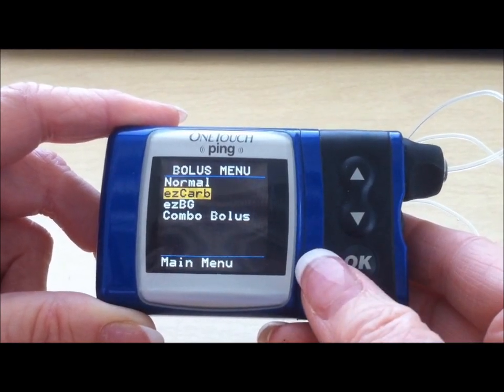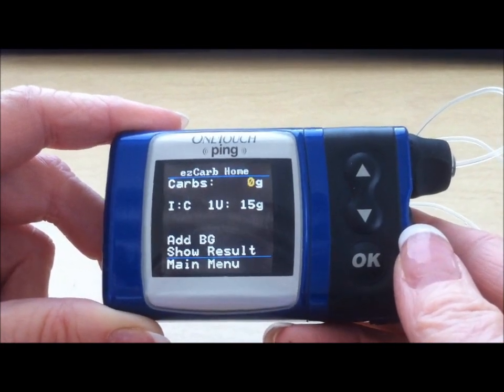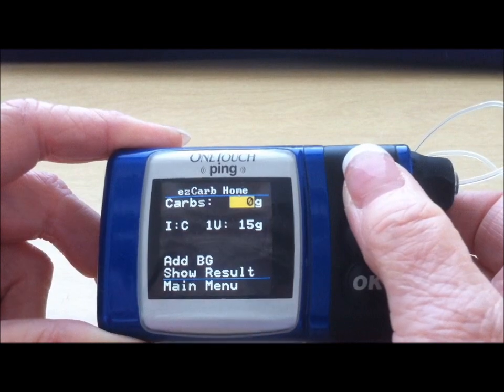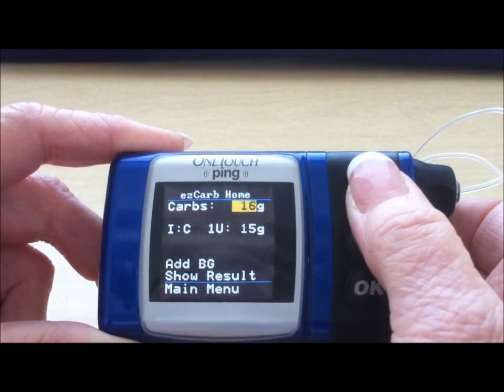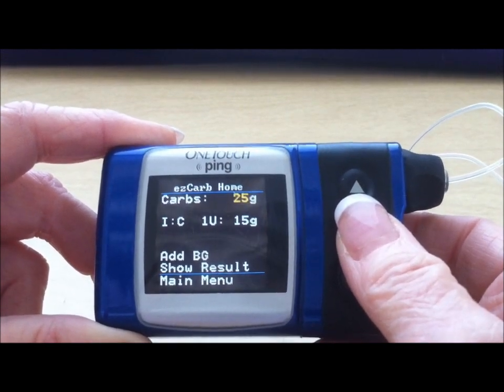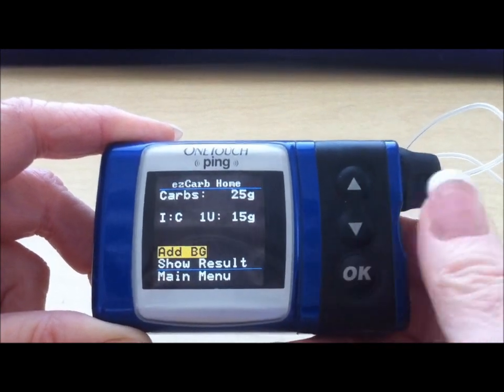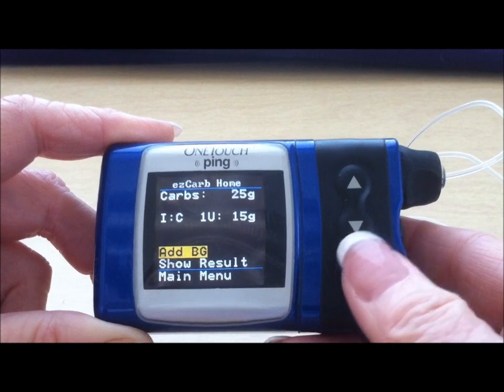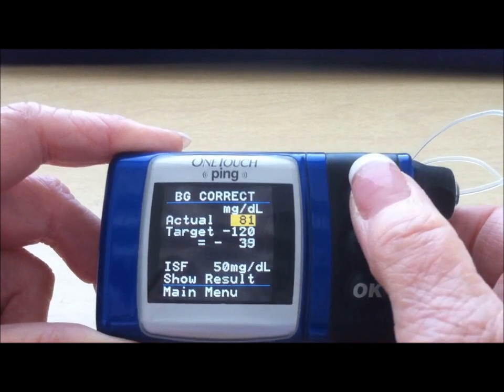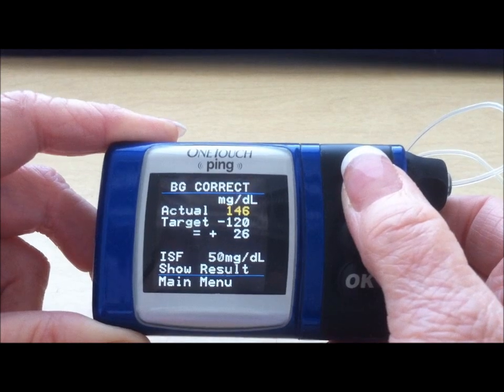You highlight EZ Carb and press the OK button. The settings are already in for the particular individual, so all you need to tell the pump is the amount of carbs that have been consumed. In this example, we're going to use 25. You can use your down arrow to toggle back to 25. Once you get the correct amount of carbs, you press the OK button. It drops down to add BG. You press the OK button, then use your up or down arrow to scroll to your pre-meal blood sugar. In this example, I'm going to use 153.